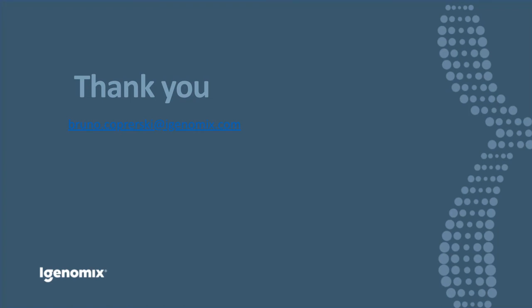Thank you. Next question, what is the sample size for NGS based research panel validation? Well, I can answer with what we performed in our lab to have this validation. So we selected around 100 samples, and of course we selected the NA12878, and also some samples that we had in our lab as positive controls, where we knew the variants and everything. Of course, some of them were positive, some of them were negative, and we wanted to see if the panel could check everything that we wanted, and we had a really good experience with that.